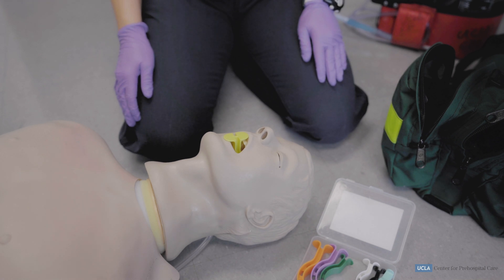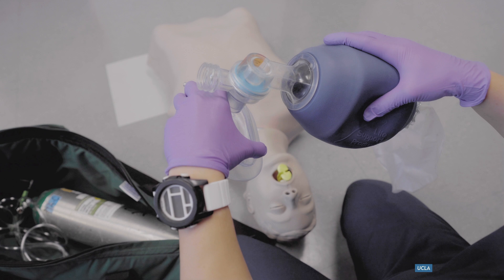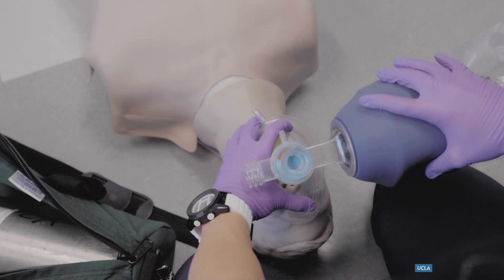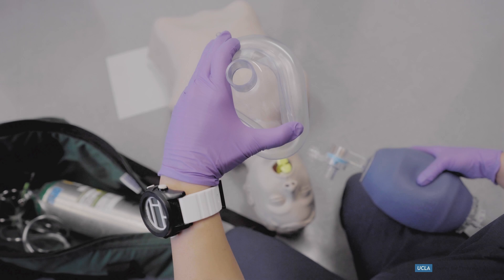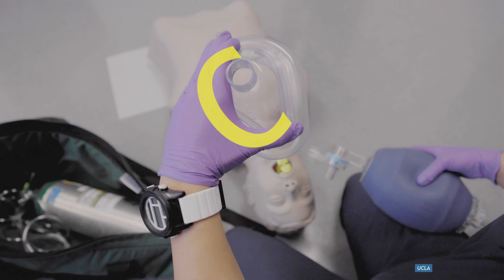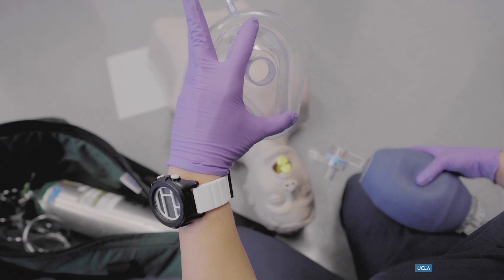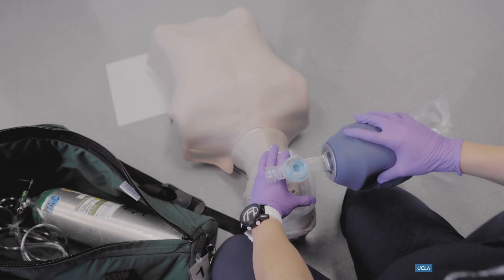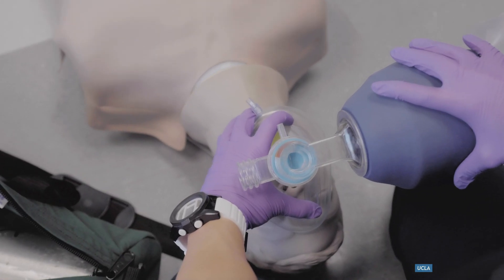We know the OPA is a proper fit when ventilation of the patient has adequate chest rise and fall. She then attaches the mask to the bag valve, placing the bridge of the mask on the nose and sealing using the CE grip. The C is the index finger and thumb to hold the mask to the patient; the E uses the remaining fingers to lift the chin and open the airway. She then administers one breath every five to six seconds. Proper ventilation is being performed without difficulty.